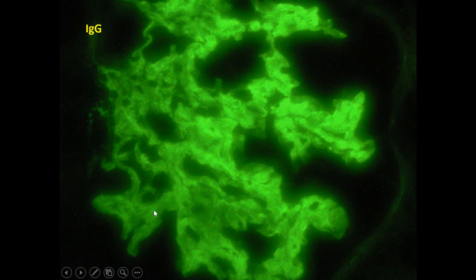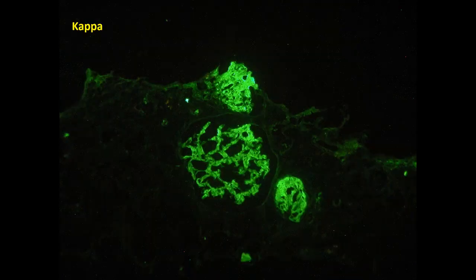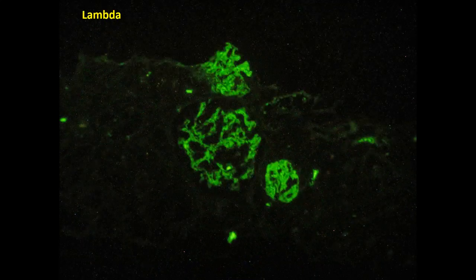IgA and IgM were negative in this case. We do have C3, which is positive. It's probably a partially sclerosed glomerulus, but it's stained positive. C1q was negative, and kappa and lambda were staining positive with the same intensity.